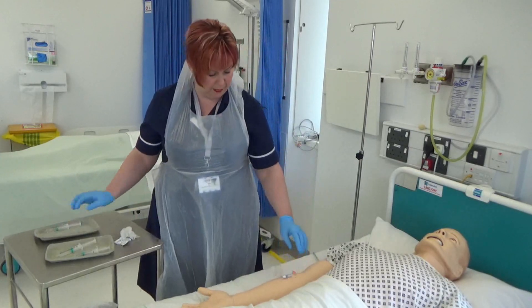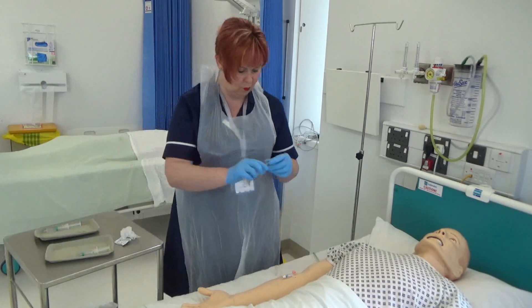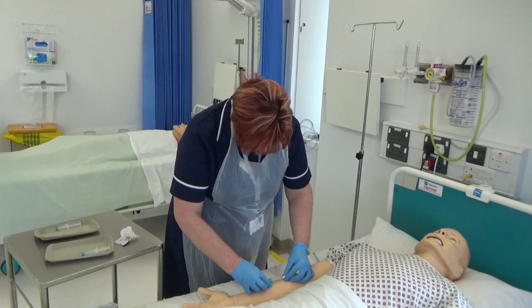Once the medication has been administered, disconnect the syringe and flush the cannula with 3-5ml of 0.9% sodium chloride for injection. This is to flush any remaining medication away from the cannula site.